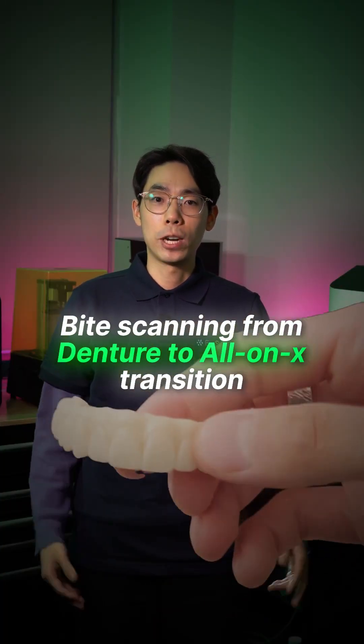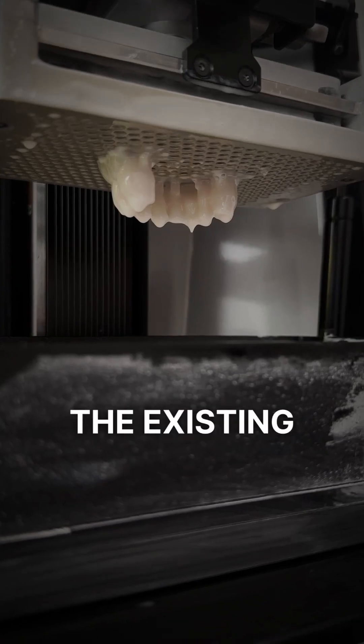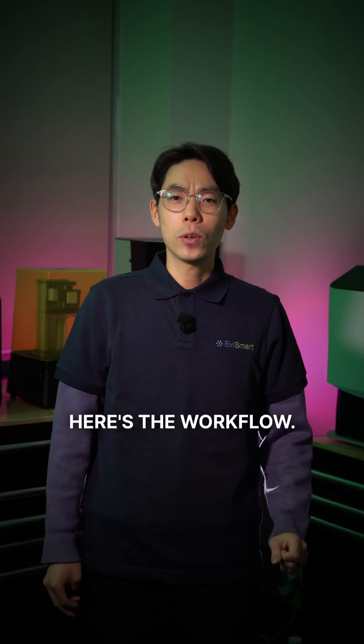Bite scanning from denture to All-on-X transition. When you are doing an All-on-X case, the existing denture is one of the patient's best bite references, as long as you can scan it correctly. Here's the workflow.